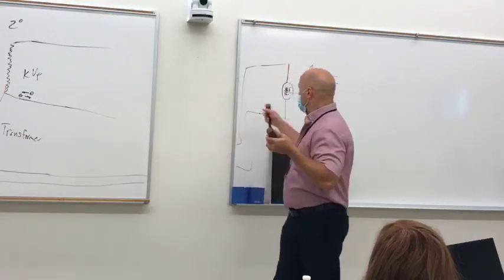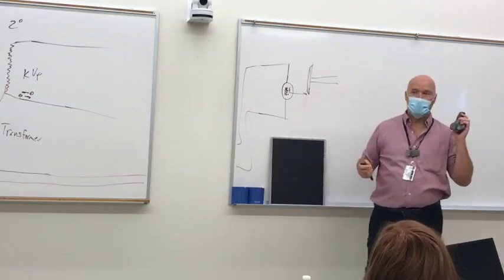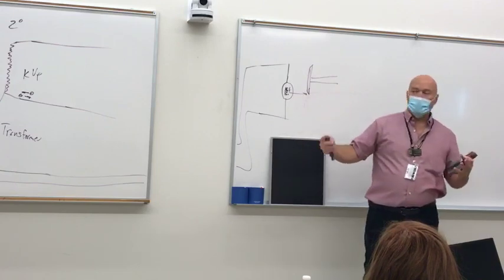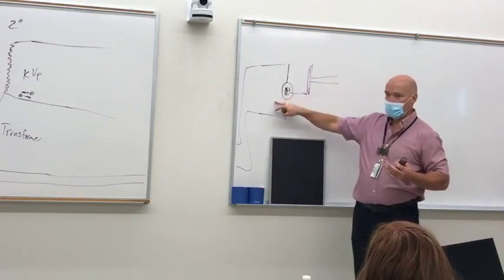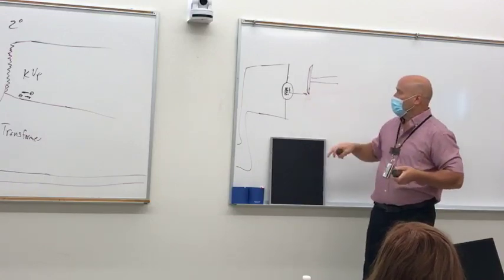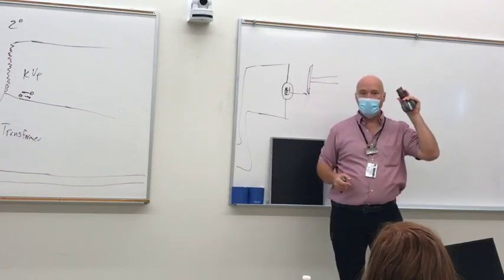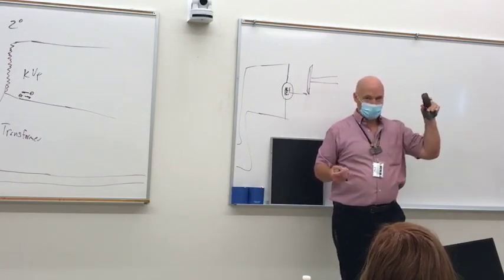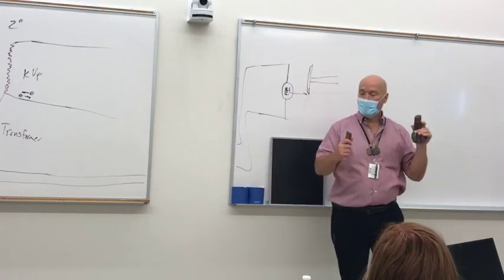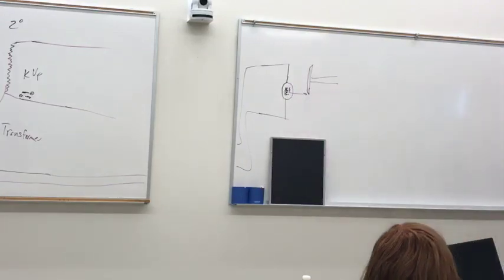If we took that stream of electrons that eventually we're going to release the potential, send them across the X-ray tube, and bombard this thing, which we call an anode. Electrical components, you've got an anode and a cathode. The cathode is the negative side, the anode's the positive side. So we've got an anode here. And if we bombard this anode with enough electrons, enough heat, it's going to melt it, and you'll see that on here. This one, you can kind of see it, this one, you can definitely see it. So let's send it this way.